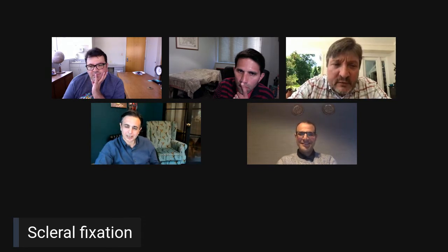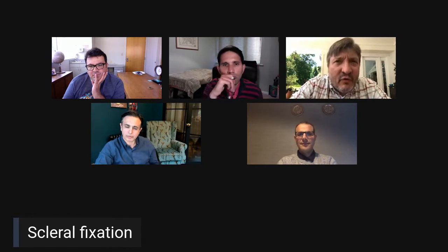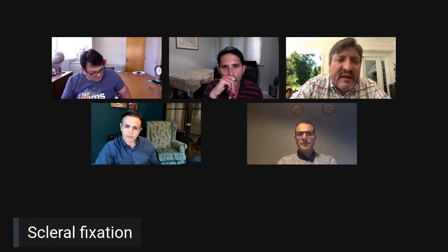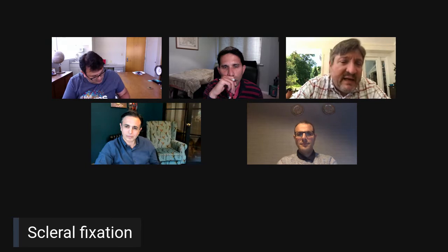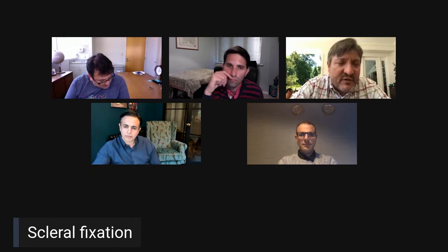I totally understand why many of our colleagues are using foldable lenses, because all of that sewing and all of that suture and all of that spaghetti makes a lot of surgeons uncomfortable, and I totally get it. So for me, again, I'm well within my comfort zone doing a case like that. That was actually my first one with the artificial iris.